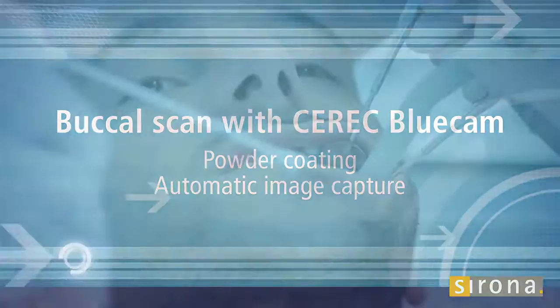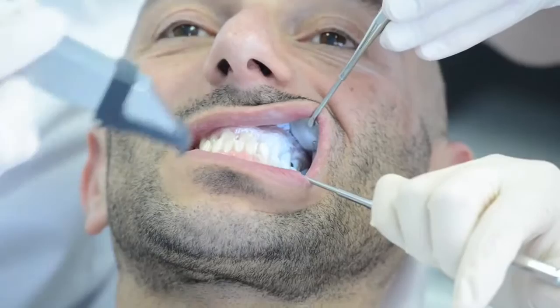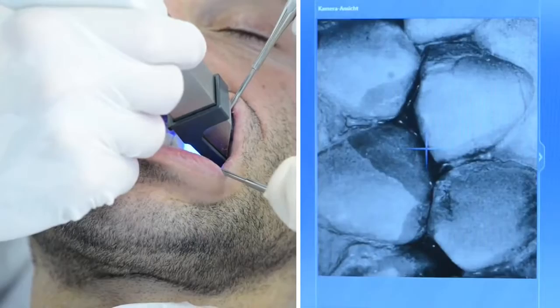The BlueCam requires powder as a contrast agent. The camera automatically detects the right moment to trigger the image, which results in a highly precise virtual 3D model.